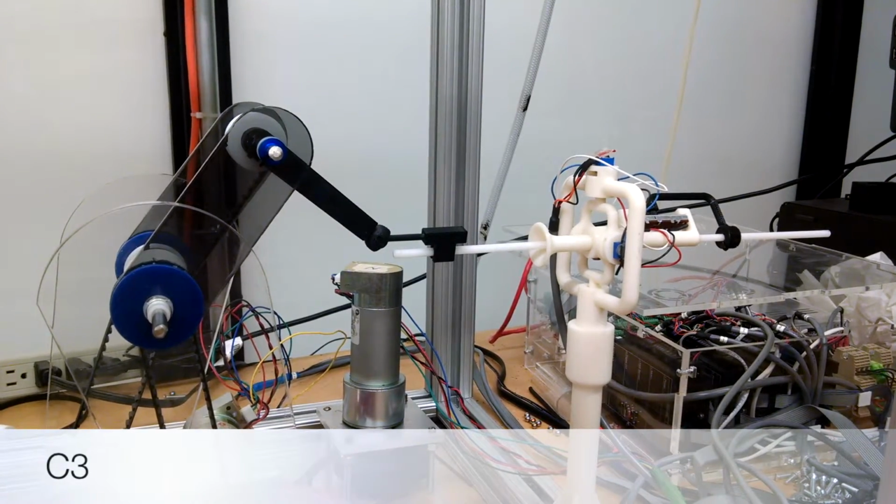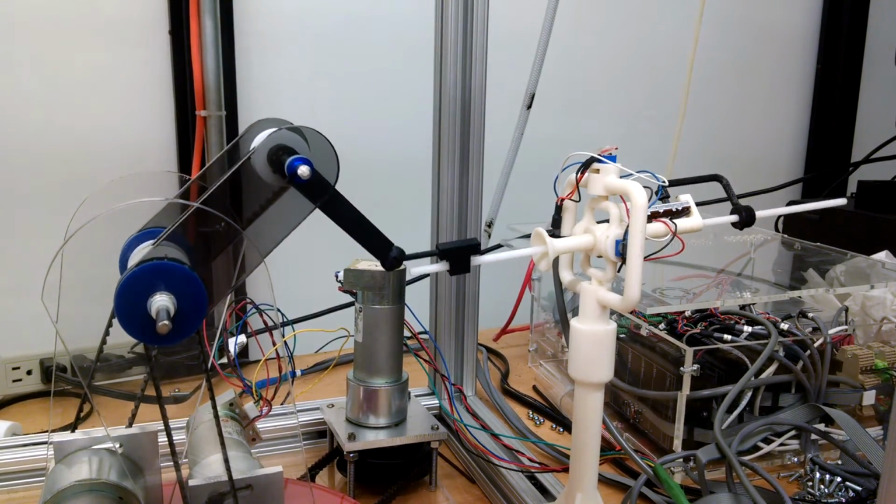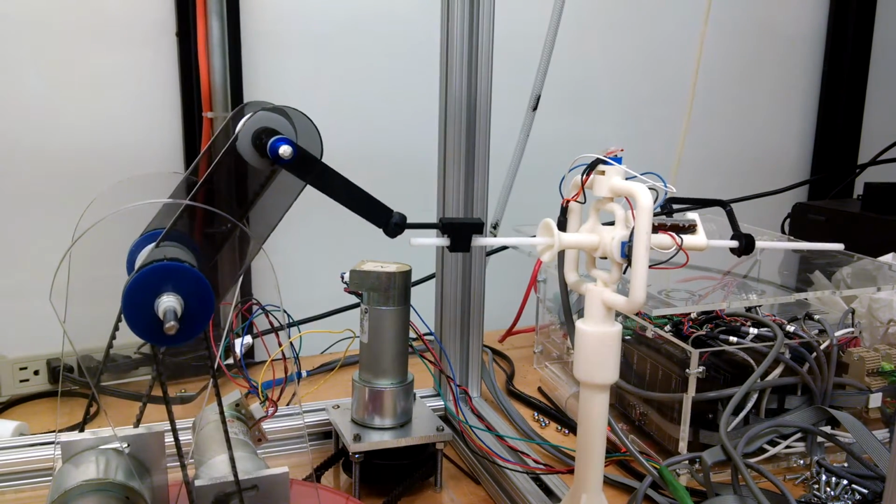This path is C3. It demonstrates the 3 different motions possible: in, up, down, and side to side.